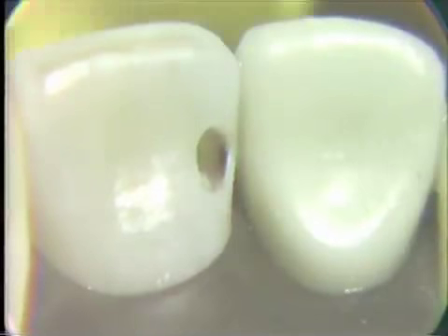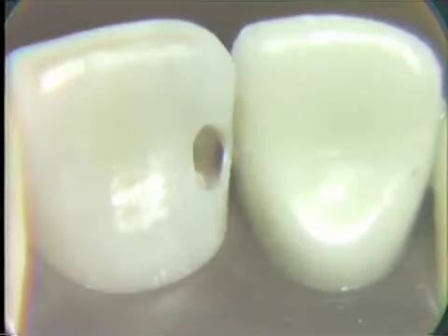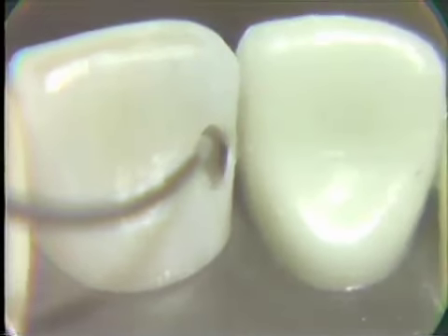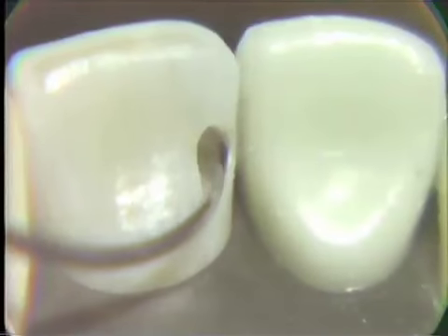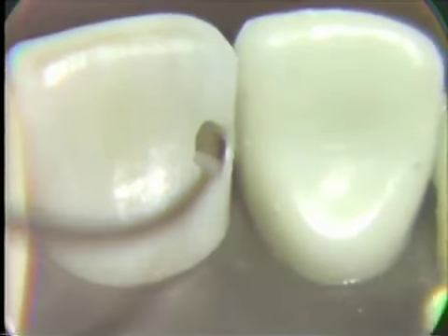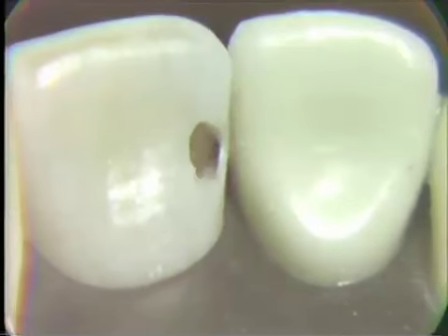We can see in this area the carious lesion as it does penetrate through the proximal area. I can get a view of caries still a bit at the dentin-enamel junction near the incisal area, just a bit more in the cervical area.